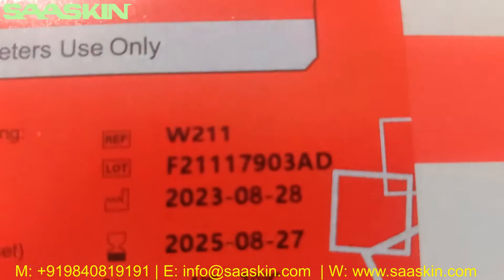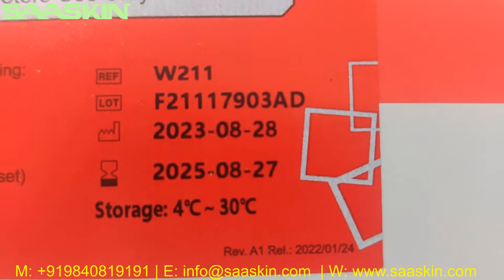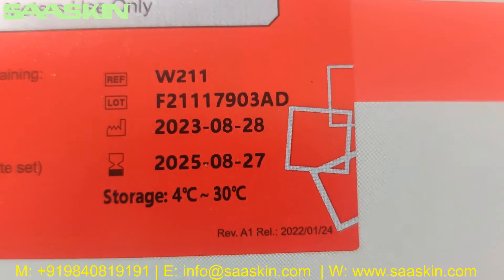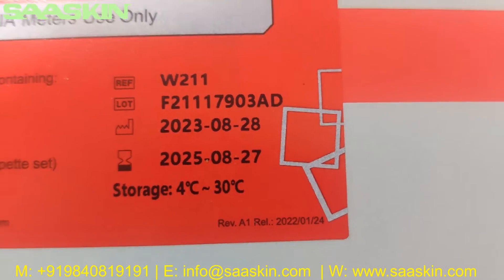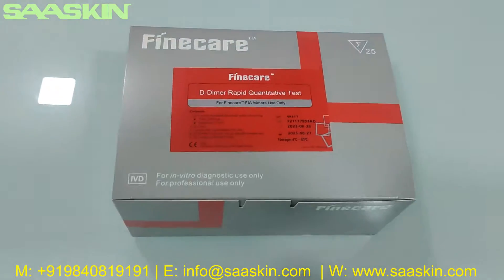On the label, you can see the reference part number is W211, along with the lot number, manufacture date, and expiry date. The kit has two years of expiry and storage is at normal room temperature.